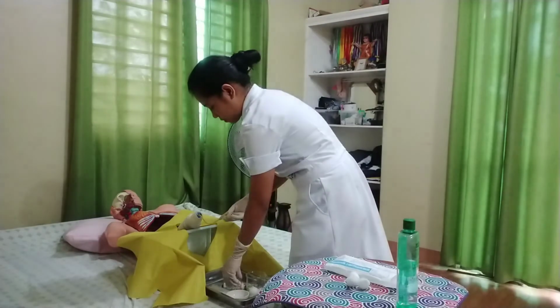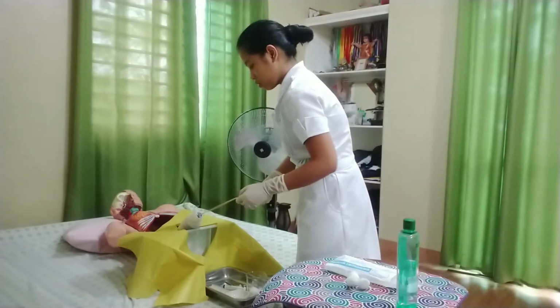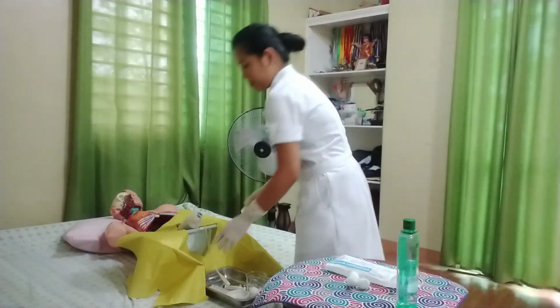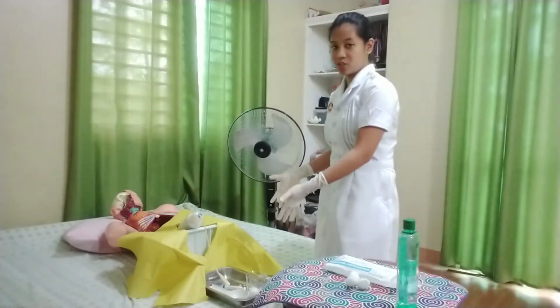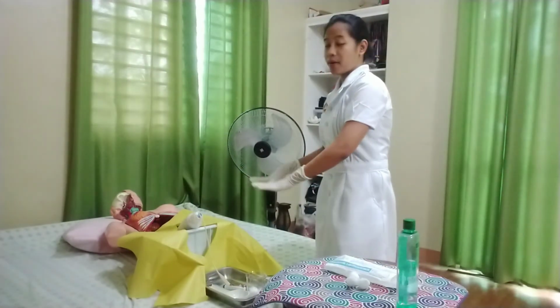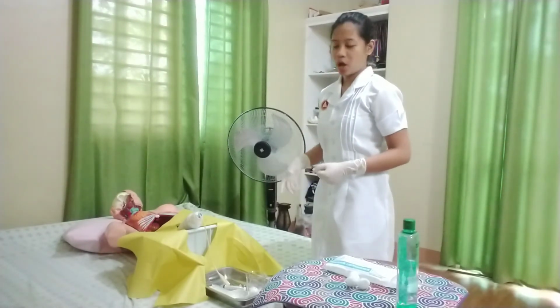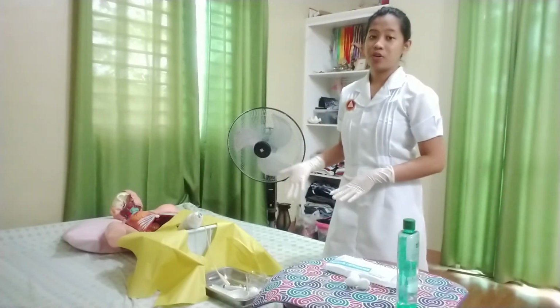And then I will tug it gently to feel resistance, so it is good. And then after that, I will secure the catheter and the drainage bag tubing on the upper thigh of my client again, using a velcro strap or a tape, and I will leave some slack in the catheter to allow for leg movement.